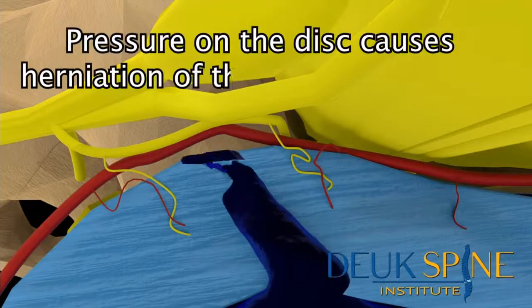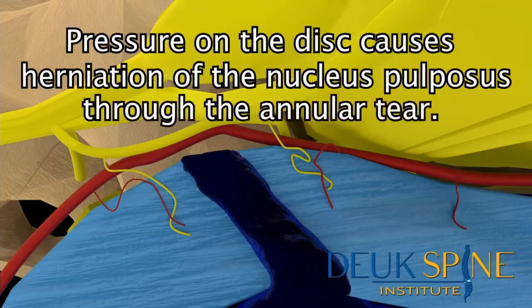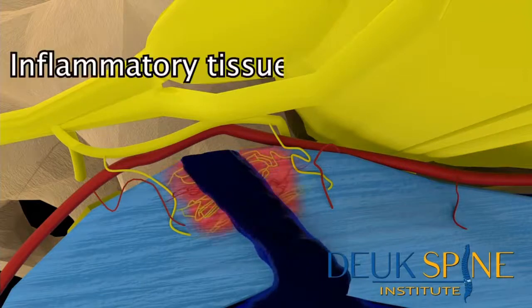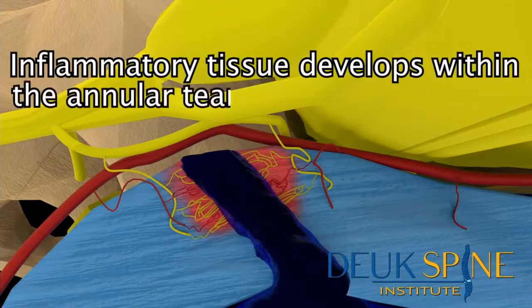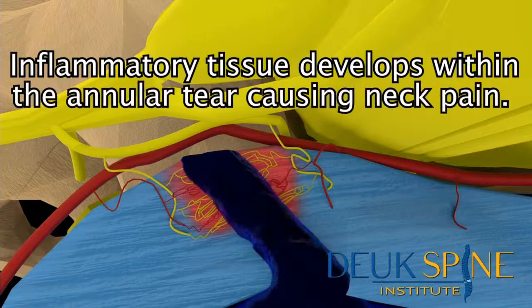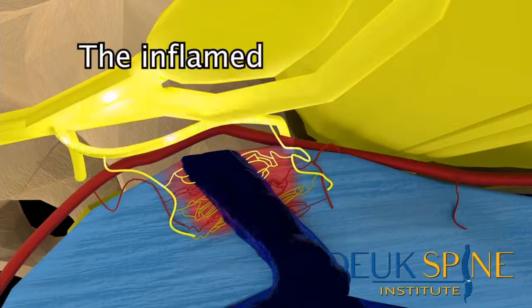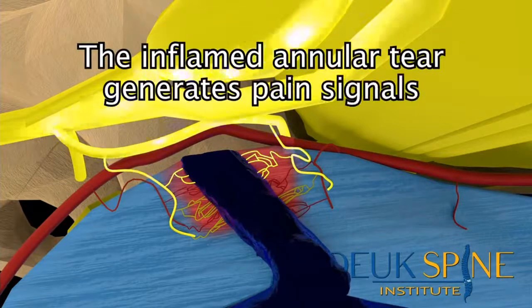Pressure on the disc causes herniation of the nucleus pulposus through the annular tear. I thought we'd be done, but this outer part is a lot more collagenized than I thought it would be. Inflammatory tissue develops within the annular tear, causing neck pain. Taking longer than I thought it would be, which is fine. The inflamed annular tear generates pain signals. She's gonna be very happy, I think, with her results.